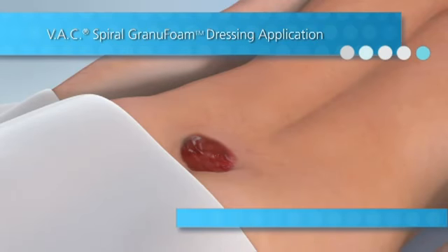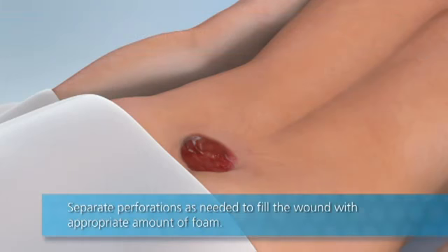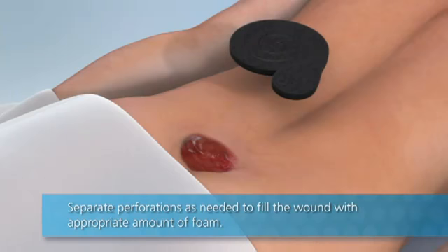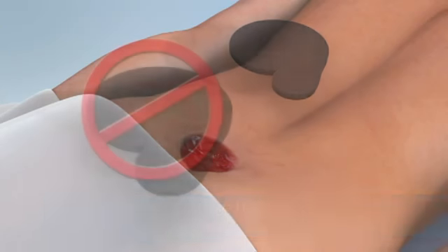V.A.C Spiral GranuFoam Dressing Application. After cleansing wound and protecting the peri-wound according to institutional or agency protocols, separate perforations as needed to fill the wound with appropriate amount of foam.